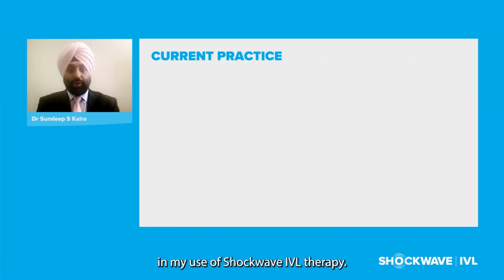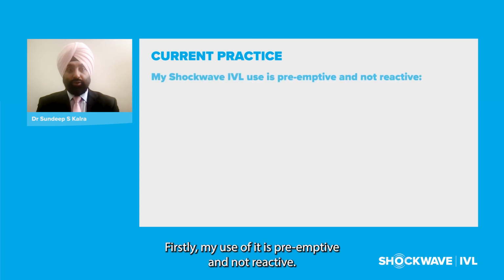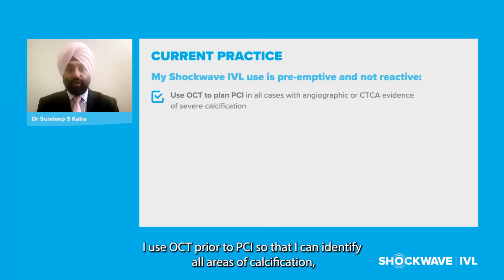My current practice has now evolved in my use of shockwave IVL therapy. Firstly, my use of it is preemptive and not reactive. So in the vast majority of cases where I use shockwave IVL, I use OCT prior to PCI so that I can identify all areas of calcification.